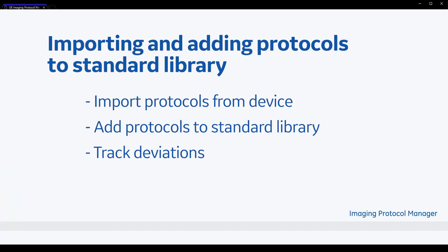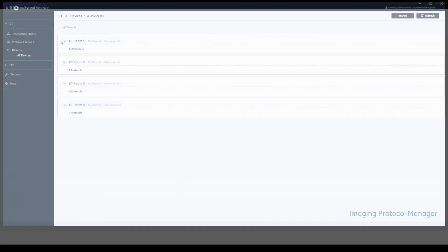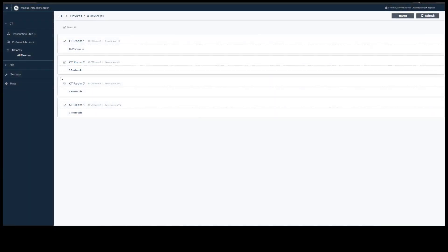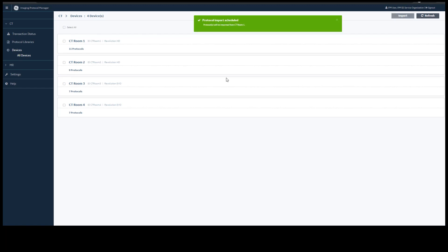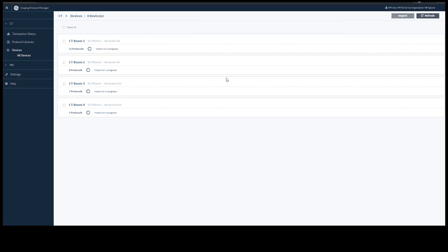Now we will go on to importing and adding protocols to your library. To import, select any device you want and select Import. This is a live import of exactly what is on your device at that time.